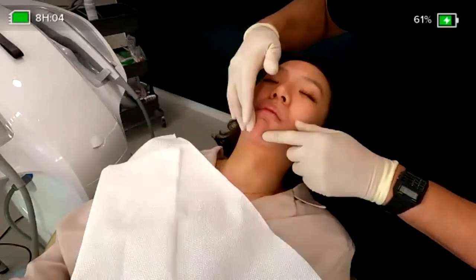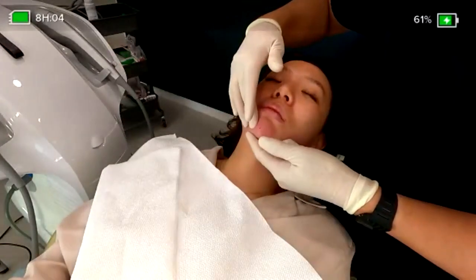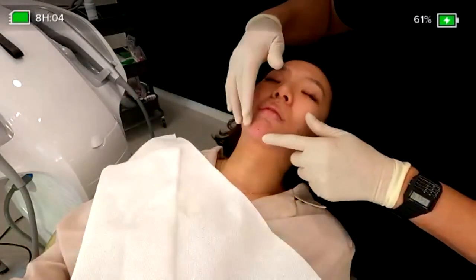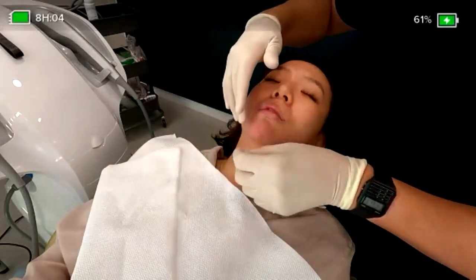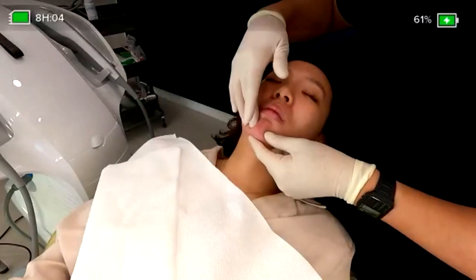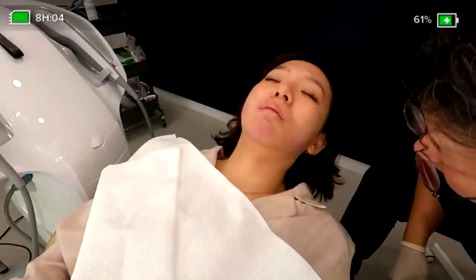I think we should ask the person we are injecting whether a longer lasting, hard filling is okay, or a mid lasting, mid hard kind of filling. Which one is better depends upon the taste. Okay.